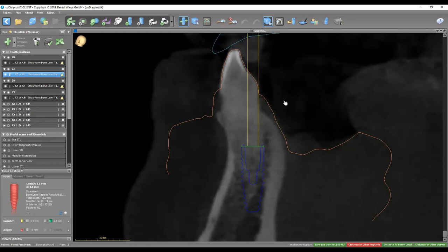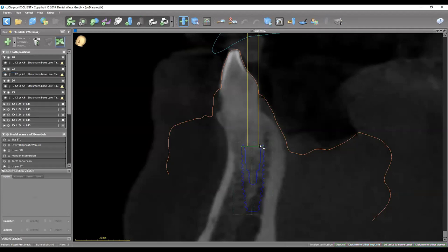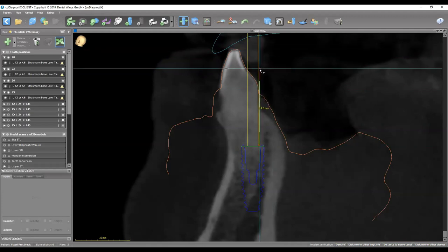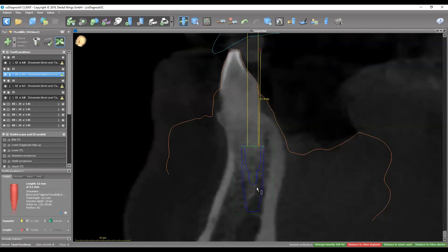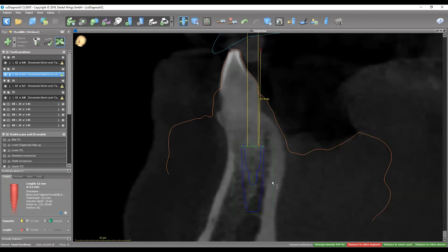Since the patient has existing teeth and we want to maintain 15 to 17 millimeters of occlusal restorative height, we'd need to do some bone reduction since the implants are going to be placed deeper. Measuring the distance from the platform to the incisal edge gives around 17.4 millimeters, and to the cingulum where the emergence is, around 14 millimeters, which is still acceptable. We usually measure the distance to the incisal edge. We use a longer implant to ensure engagement of more bone apical to the socket for greater stability at time of placement.